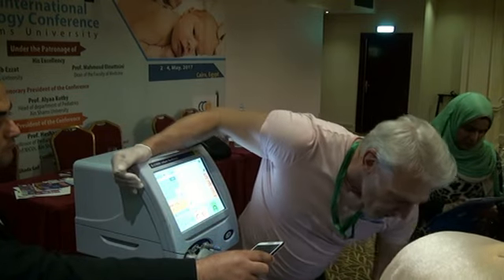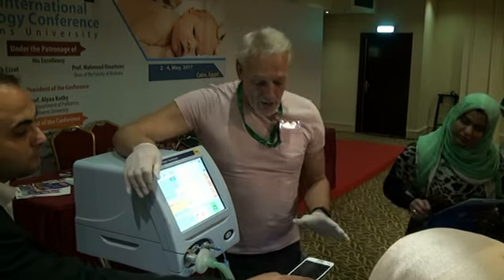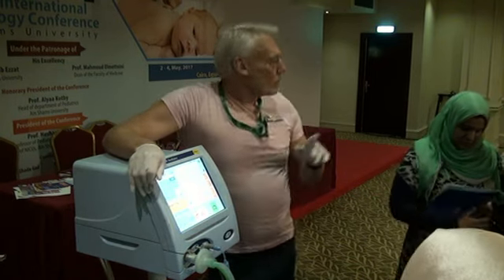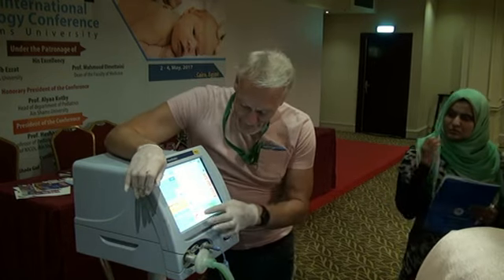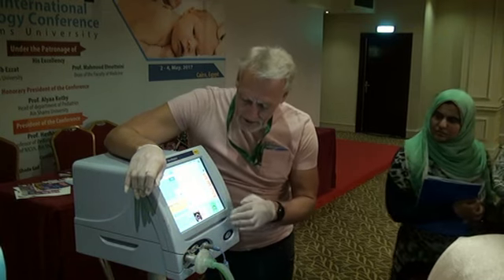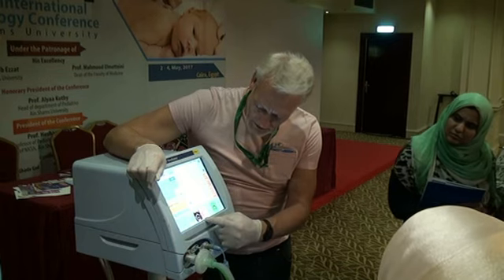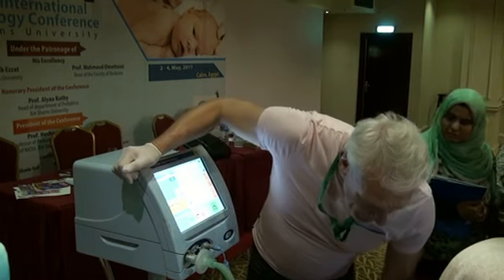And in actual fact, we could probably go further because there's still some underinflated lung tissue here. Not much, but there is. So whether the machine will deliver it, I think the machine's struggling. It's not the machine's fault, it's the pressure of what's coming out of the compressor, because we're not in a hospital setting. But I could try and put that up again by a couple and just see where we go. I'm not sure it's going to make a big difference. Maybe I'll get a bit higher. It's reading 26 on 15, possibly, and maybe that'll get a bit pinker.